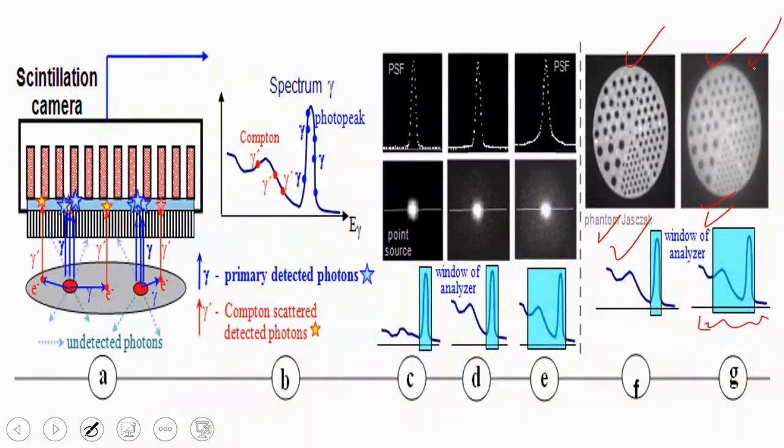When I had a very large window, the resolution here was very low, and your contrast was poor. However, when your window was small, the resolution improved. I use this test or this examination to test SPECT resolution, SPECT uniformity, or SPECT contrast, as we will see.